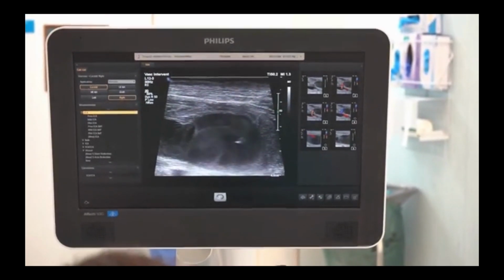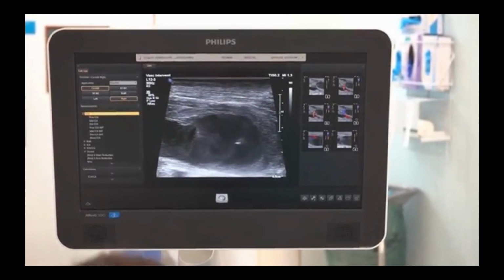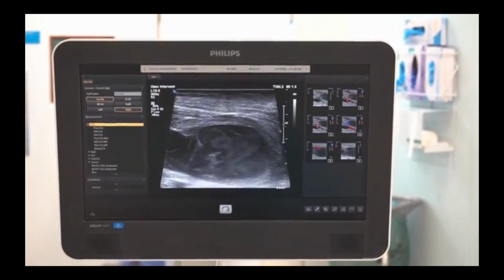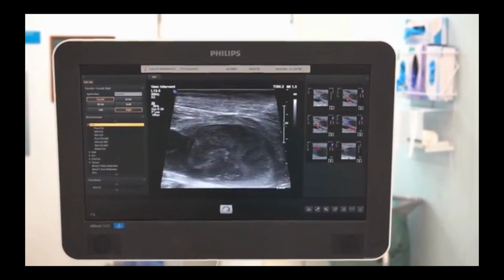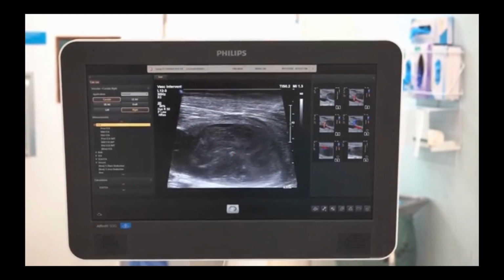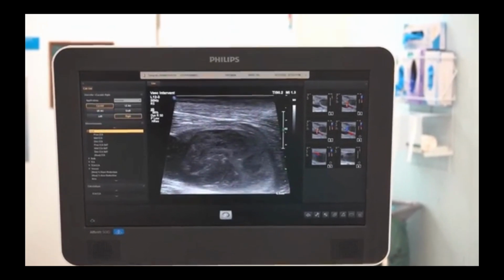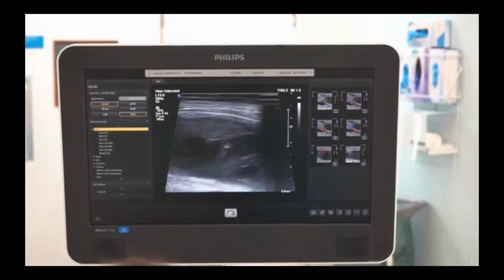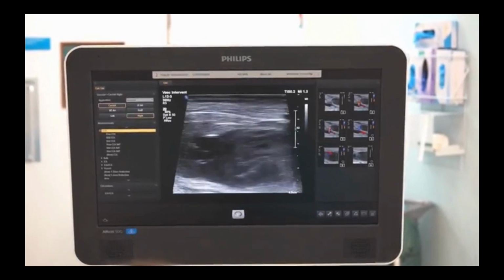And there you can see the needle longitudinally in this instance within the pseudoaneurysm. We're just going to inject the thrombin, just a small amount. You can see immediately you get thrombosis within the pseudoaneurysm, and there's no flow whatsoever. And we'll put some Doppler on in a moment, and you'll see that the aneurysm is completely occluded.